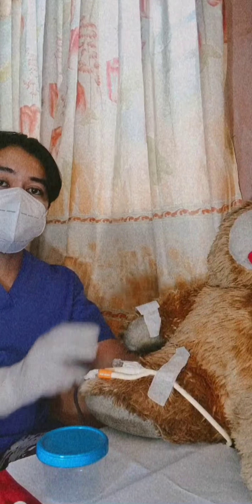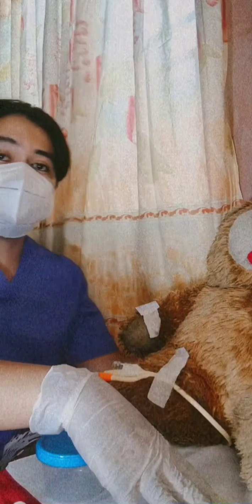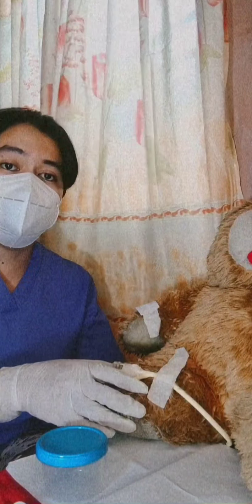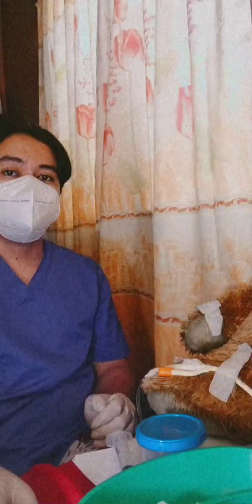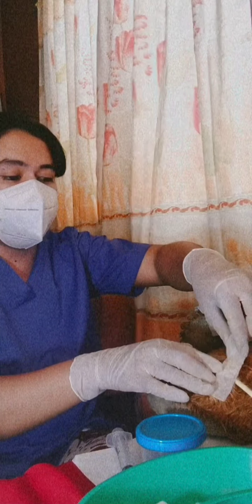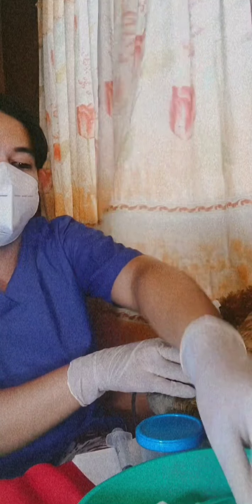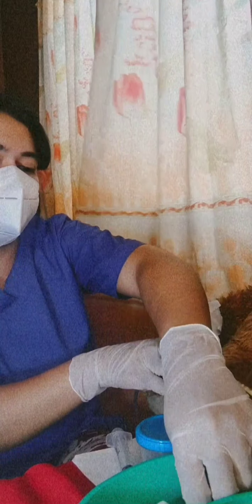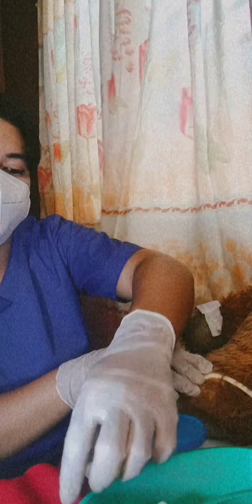Next, place the patient in supine position, and then place a waterproof pad between the patient's thighs, and then obtain a specimen if required. Next, we need to remove the adhesive tape anchoring the catheter, and then remove any residue of the adhesive from the patient's skin.